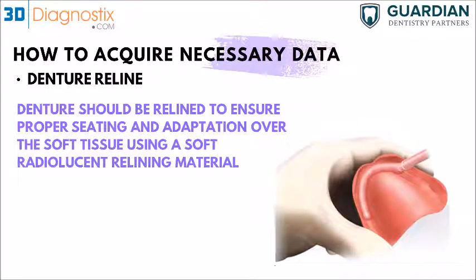Okay, so if the patient has an existing denture, again, as mentioned, you need to make sure it's relined. We recommend relining the denture with a soft reliner that is radiolucent and not radiopaque, because if you use a reliner that has radiopacity to it, it would generate a lot of artifacts, and it's just going to make it difficult to see the anatomy, especially the soft tissue anatomy in the scan.